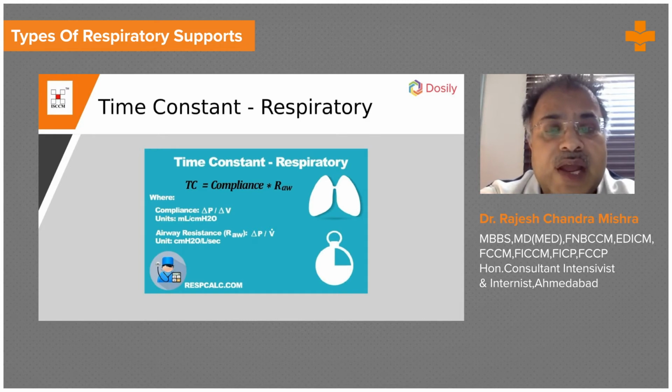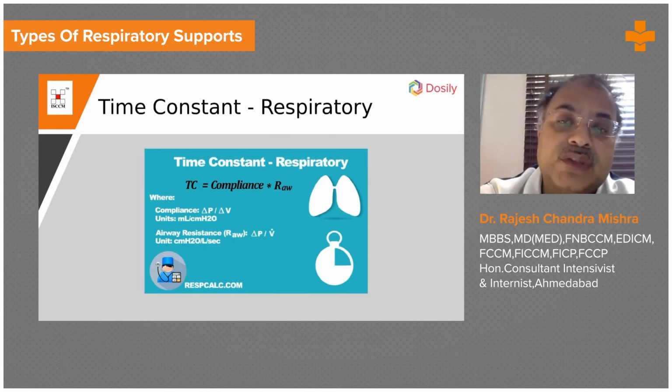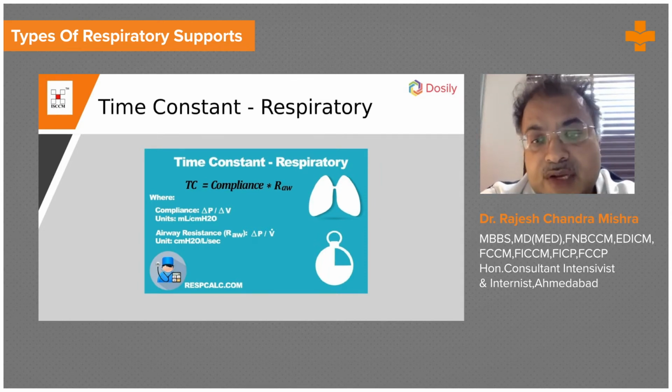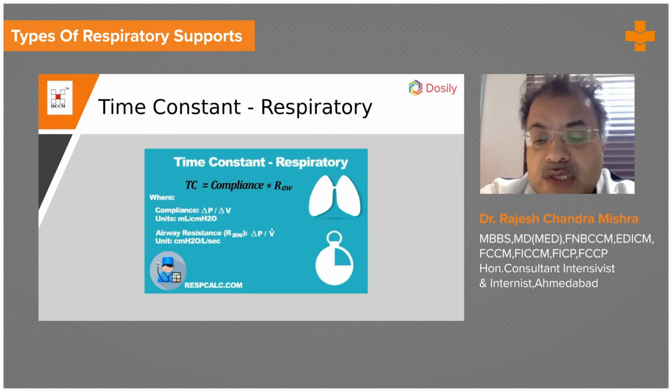Classically, when there is severe hypoxemia, it is 1:1, but never in inverse ratio. But when it is COPD or asthma or obstructive airway disease, then you ventilate in the ratio of 1:3 to 1:8. So if you understand this basic concept, it will be very easy for you to initiate ventilation, keeping the patient's pathophysiology or pathology in mind.